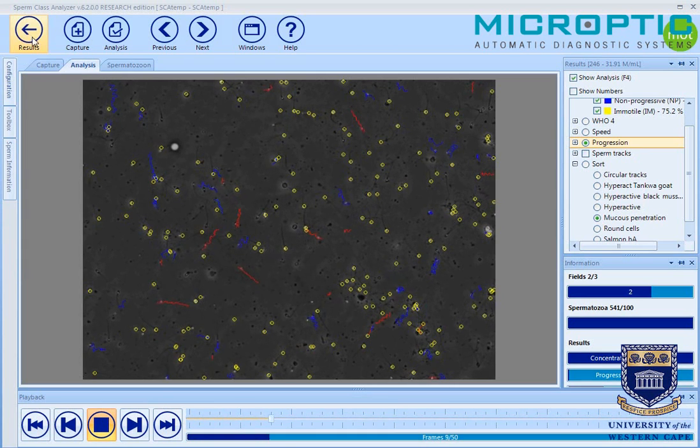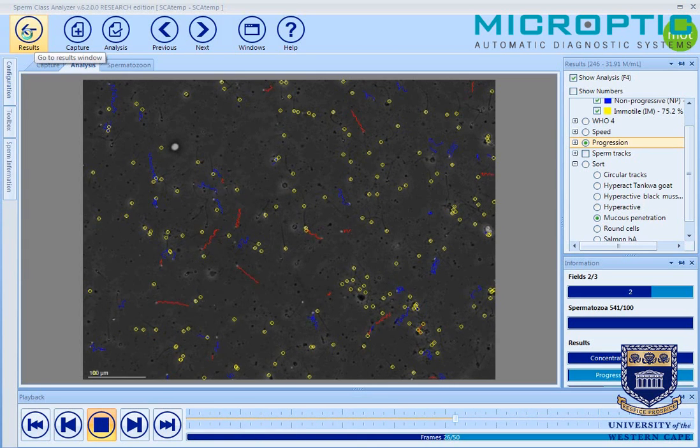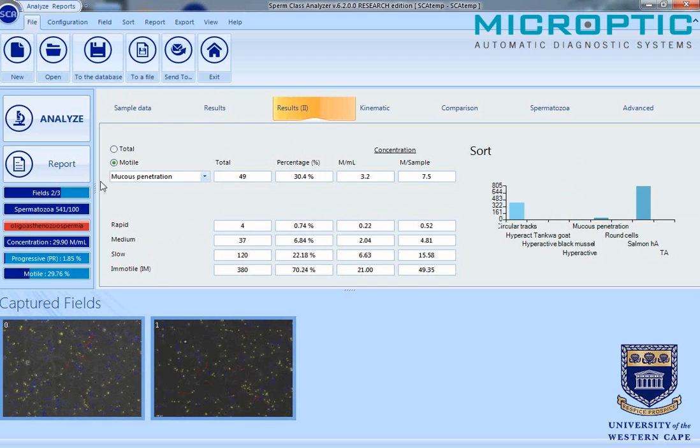Viewing the results and going to the second results screen in SCA, we can look at the motile fraction and see the sperm that passed the mucus penetration test. We don't look at the percentage, but at the number of sperm in the ejaculate. In this particular case, it represents 7.5 million sperm in the ejaculate.